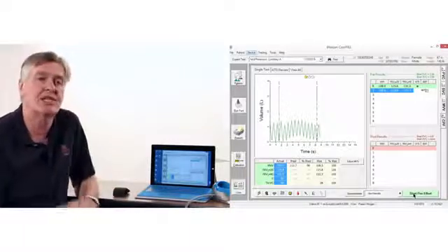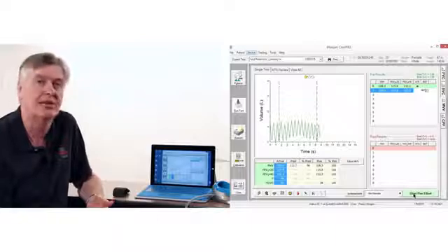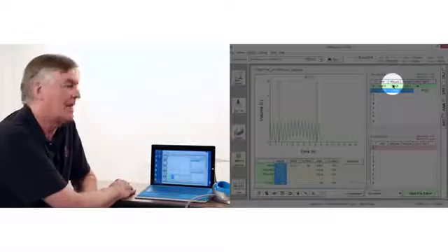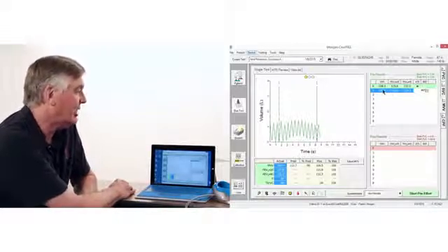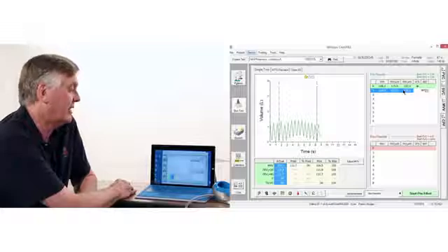So those patients that really run out of gas, so to speak, before the 12 seconds, we can still record an MVV. On the screen, we show the FEV1 times 35 and the FEV1 times 40 compared to the MVV. And in this case, even though I cut it short, her MVV is an excellent effort. So I could accept that and move on.